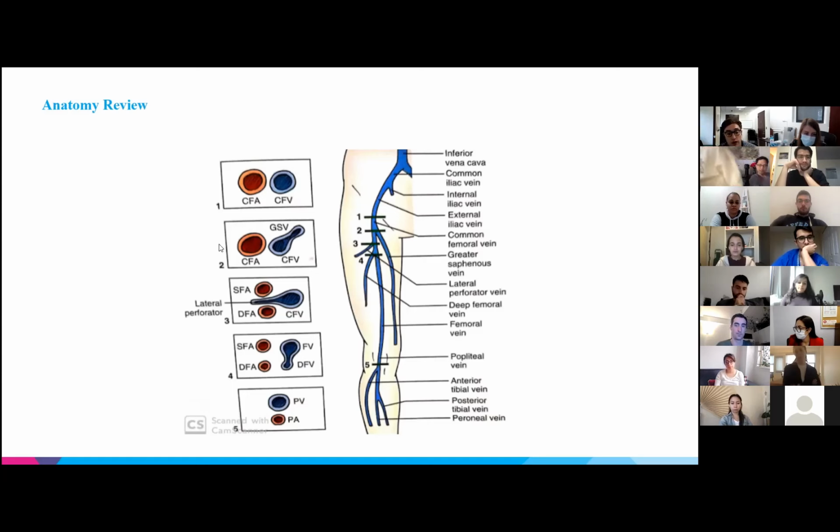So for your femoral views, you basically track down until you see these 4 vessels. And you really want to compress every centimeter or so, and every time you see a branch point. Once you reach this point where you see the 4 vessels, then you can jump down to the popliteal, and really the popliteal vein is going to be on top of the popliteal artery, and you just compress once, and then that's your quick DVT study.